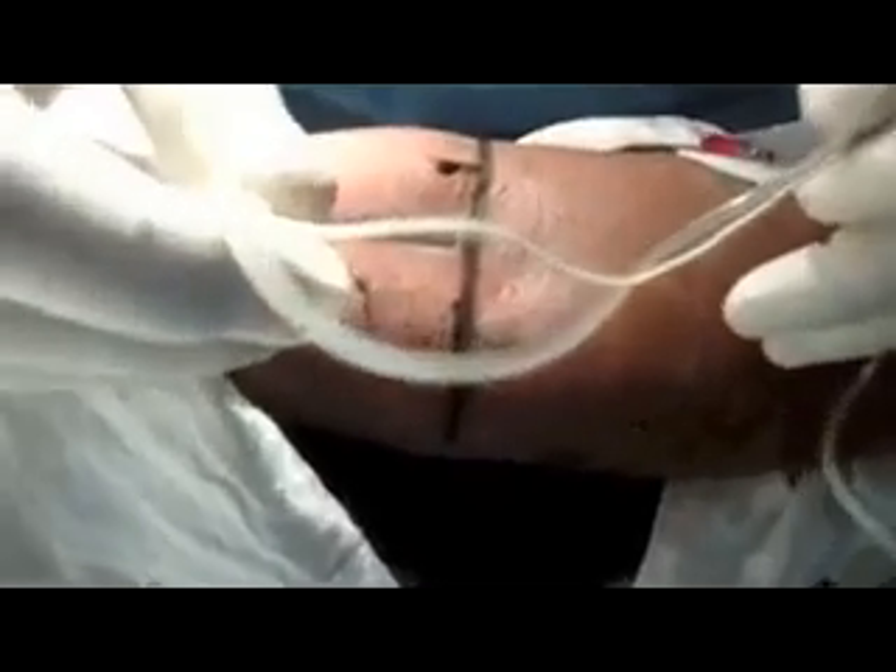I have infiltrated the area. Go directly vertical like this. This is the wrist response — you can see this is the extension of the wrist.